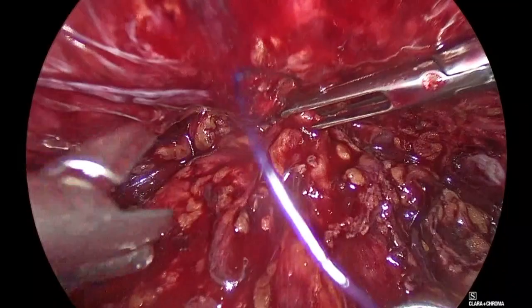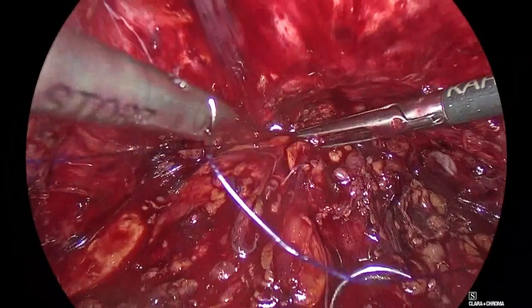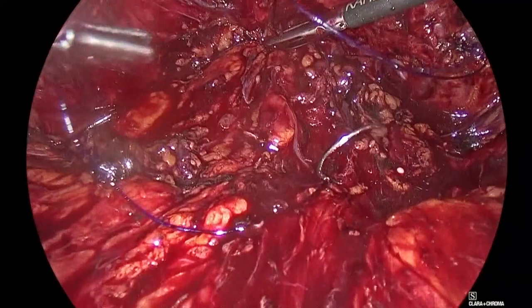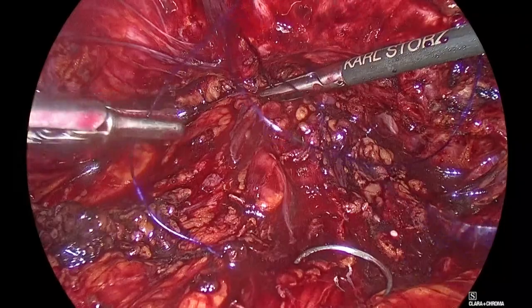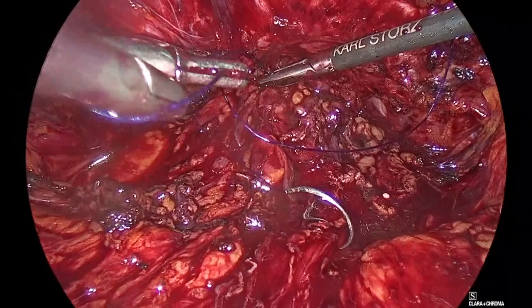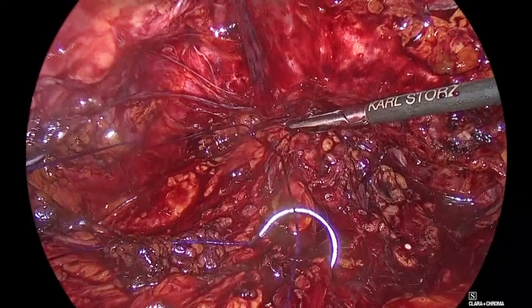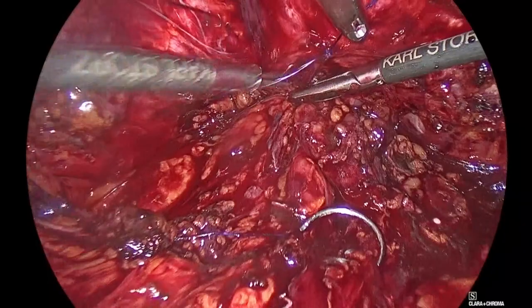Panagiotis, you didn't grasp it. Come on, Panagiotis. Both. Come. Good. Go back. Especially when the anastomosis is watertight and you don't do lymphadenectomy. I know, but go back. My feeling is that. But I will tell you something, that our drain comes out with something like 70 to 80 cc's or 100 before we take it out. Why should this stay inside? I don't know. I don't get it. What is wrong by putting a drain? What am I risking?